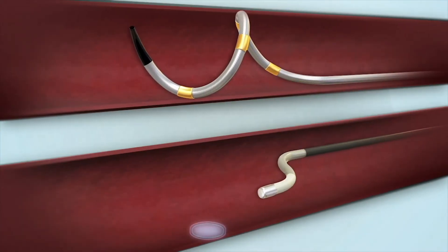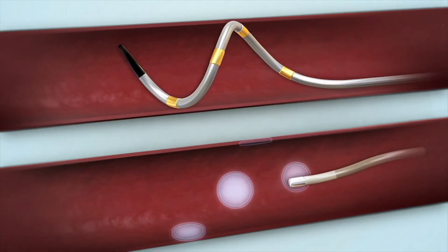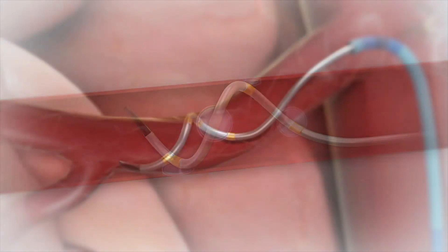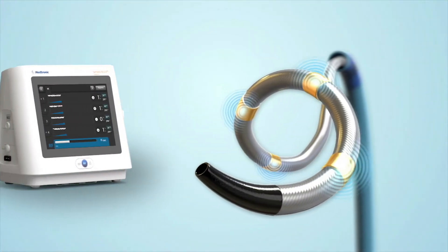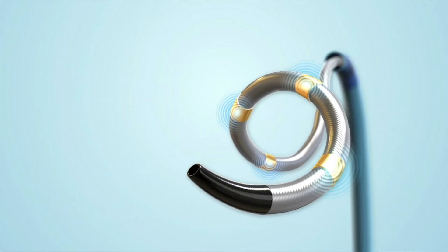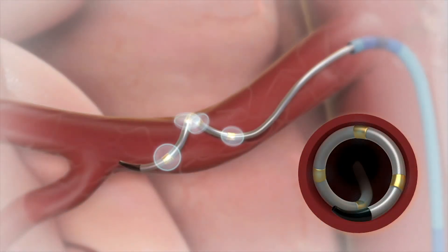The Simplicity Spiral catheter uses the same helical ablation pattern established by the proven Simplicity Flex catheter. The energy delivery from the Simplicity Spiral catheter is controlled by the Simplicity G3 generator. The generator allows the physician to monitor the impedance and temperature measurements of each electrode. The RF energy is delivered simultaneously through all four electrodes and utilizes Simplicity algorithms that safely and effectively lower blood pressure.